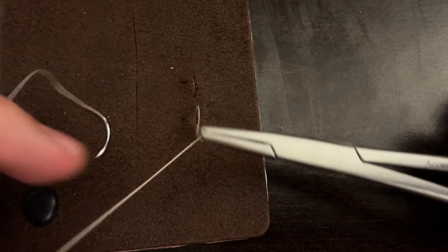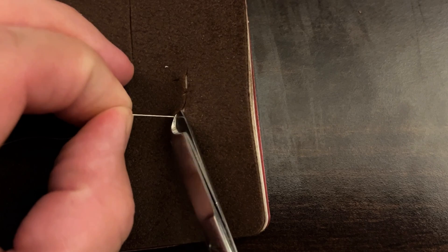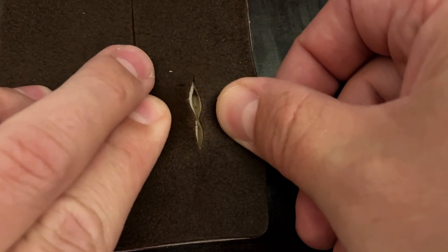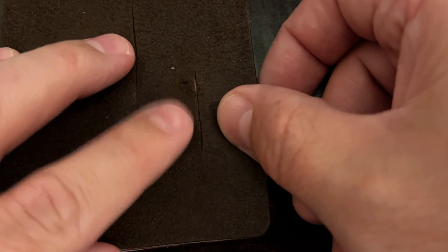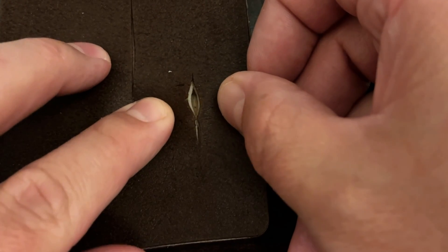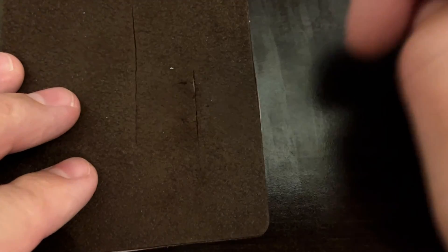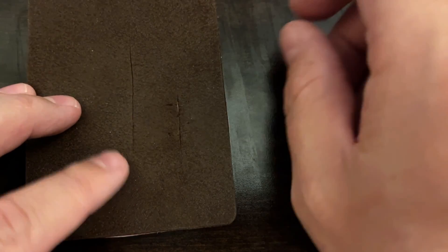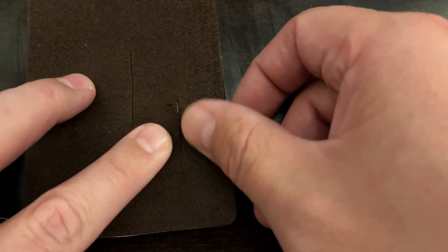I forgot to mention another place we oftentimes use this technique: in the operating room after laparoscopic surgeries, at the trocar sites where the trocar passes through the abdominal wall. When we close those, it's often just an incision about a centimeter or so, and throwing one subcuticular interrupted suture like this and then dermabond over the top is a common way to close those trocar incisions.